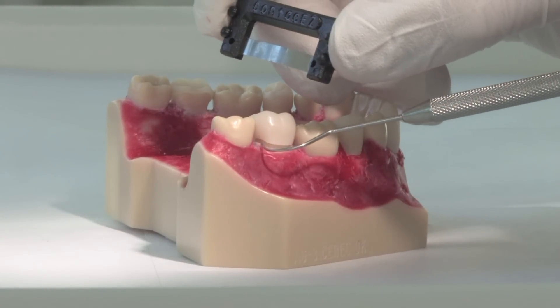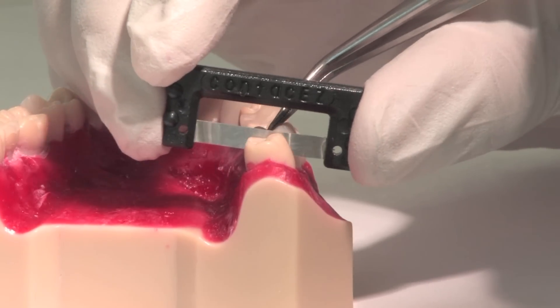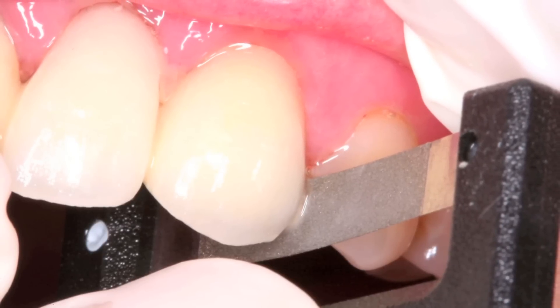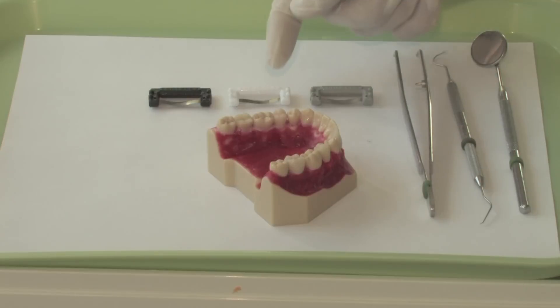Then insert and pass the strip on the distal side. When you find that one side is tighter than the other, the tighter side has heavier contact. Pass the strip five to six times on the tighter side. When you feel equally light resistance in both interproximal spaces, the proximal contact adjustment is complete.